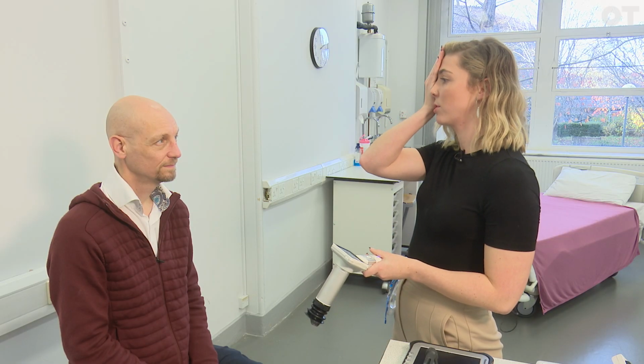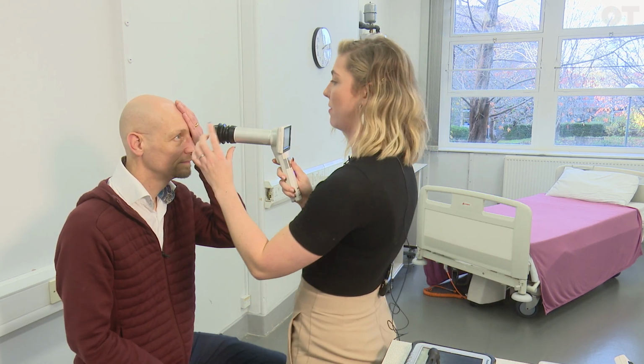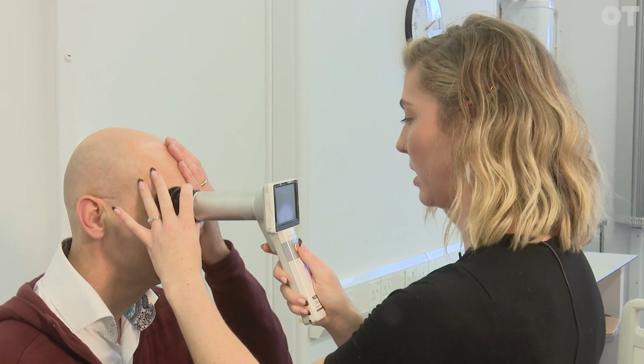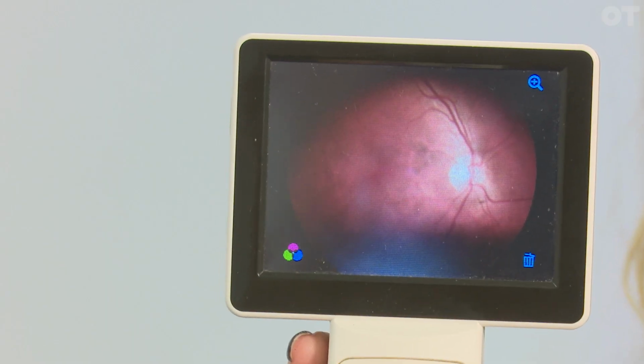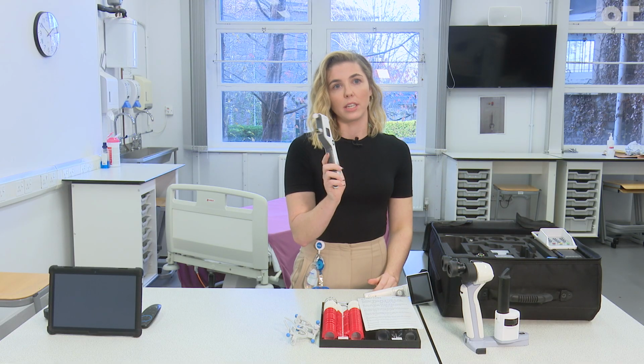If I can ask you to hold your hand just over your left eye for me so it covers it perfectly. And if you look in here, you should see a little green flashing light. That's perfect, thank you. There'll be a bright flash. Fab. Beautiful.